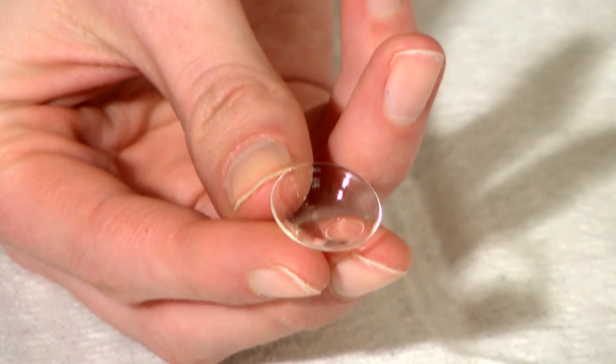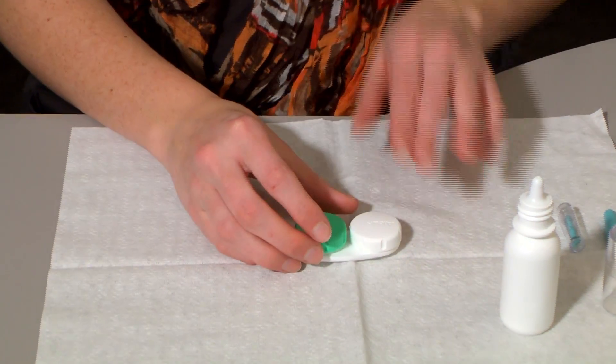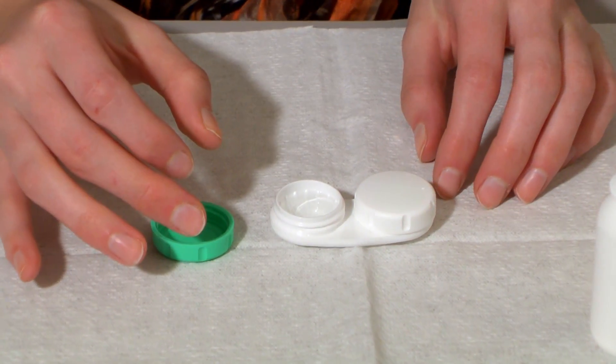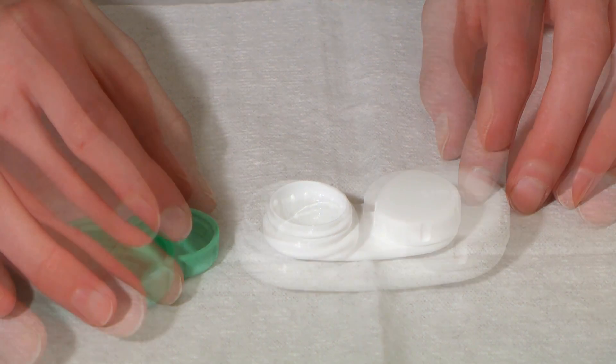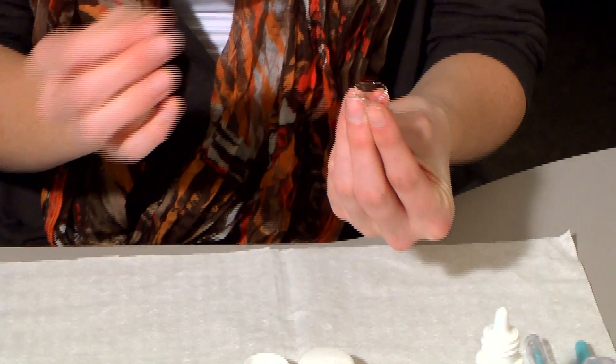Even though your contact lenses may have different prescriptions, they may look identical. To avoid mixing them up, get into a routine and always start with the same lens when you apply, remove or care for them. We'll begin with the right lens. Gently remove the right scleral contact lens from the case by sliding it carefully out of the case.